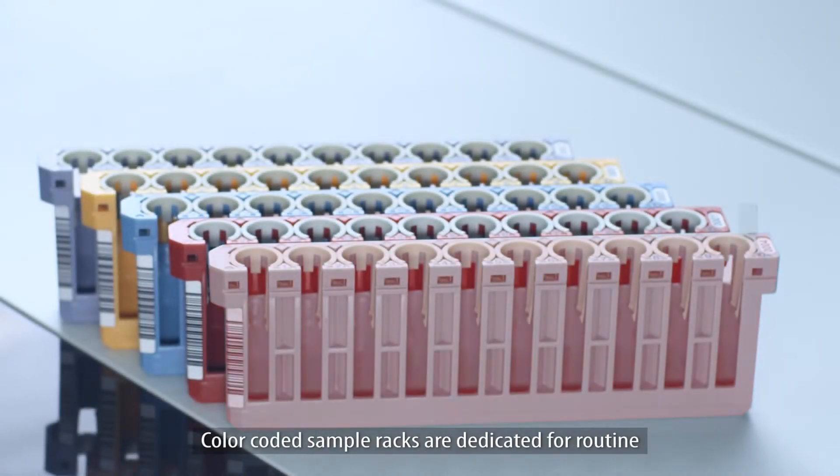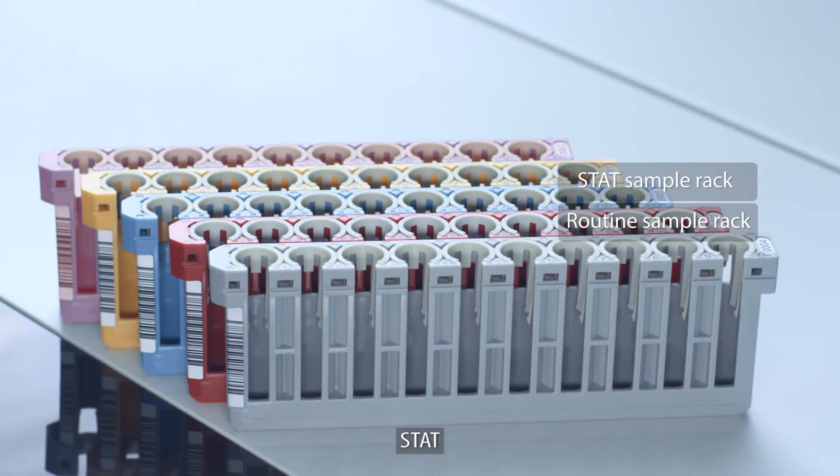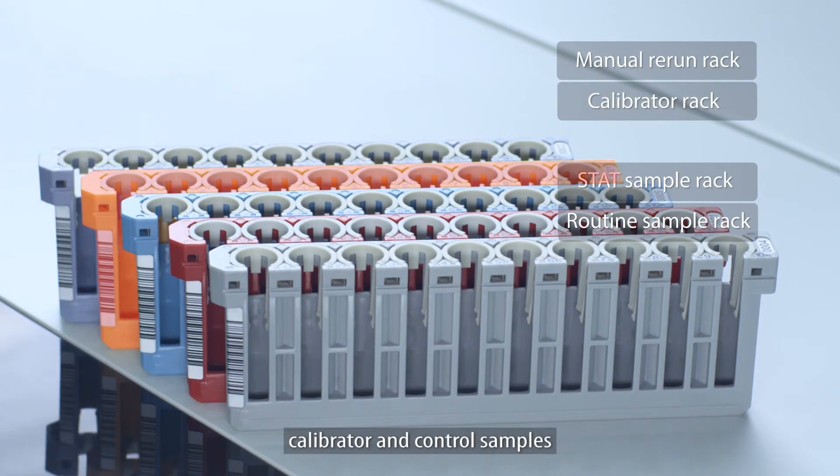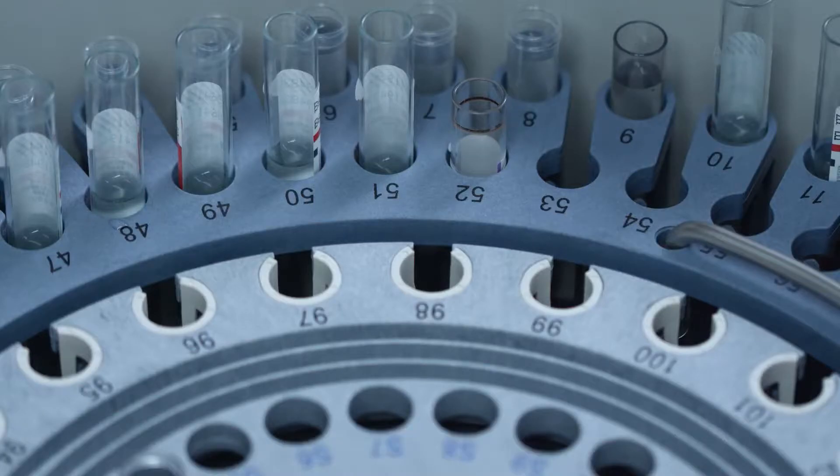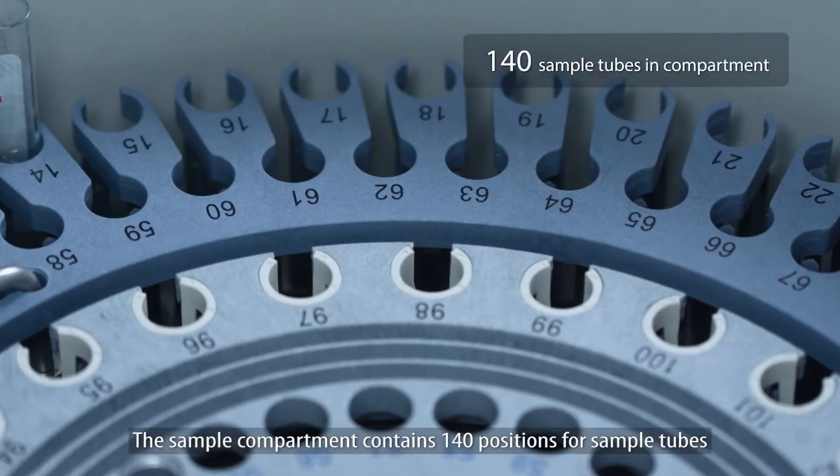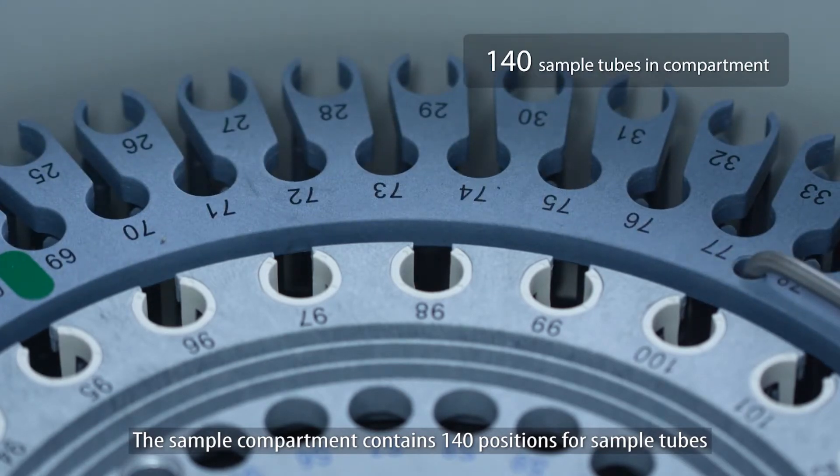Color-coded sample racks are dedicated for routine, stat, rerun, calibrator and control samples. The sample compartment contains 140 positions for sample tubes.